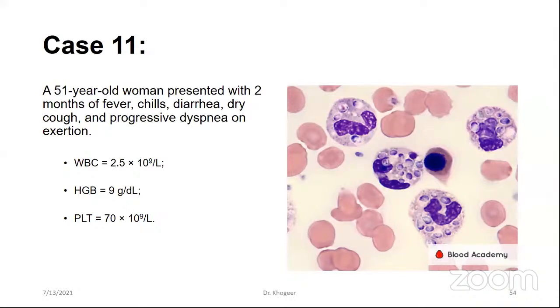Okay, reactive lymphocyte. As I said, reactive lymphocytes mean lymphocytes showing or starting to show some variation or alteration in the morphology that is not similar to the normal or typical classical one, because the classical lymphocyte is a small cell, double the size of the RBCs, with condensed chromatin and a high N/C ratio.